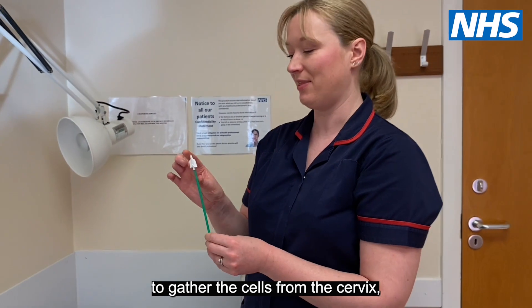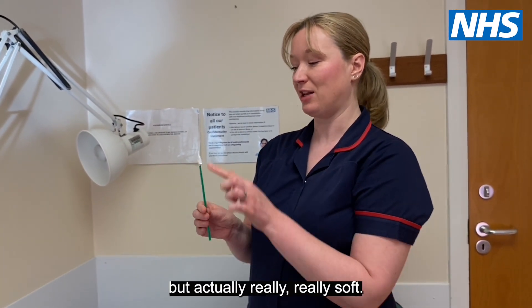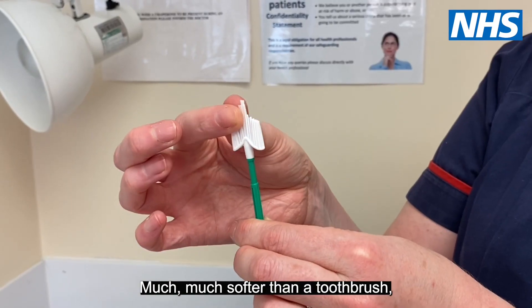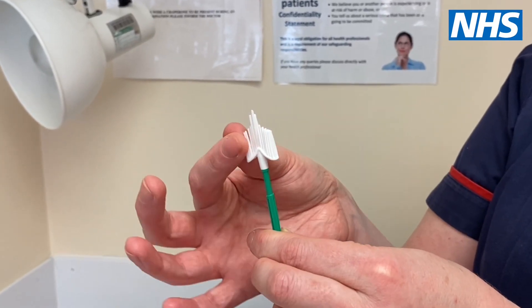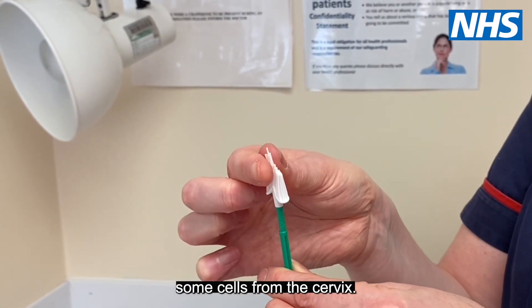The purpose of the brush is to gather the cells from the cervix. It looks a bit hideous but is actually really, really soft — much softer than a toothbrush — and it will just capture some cells from the cervix.